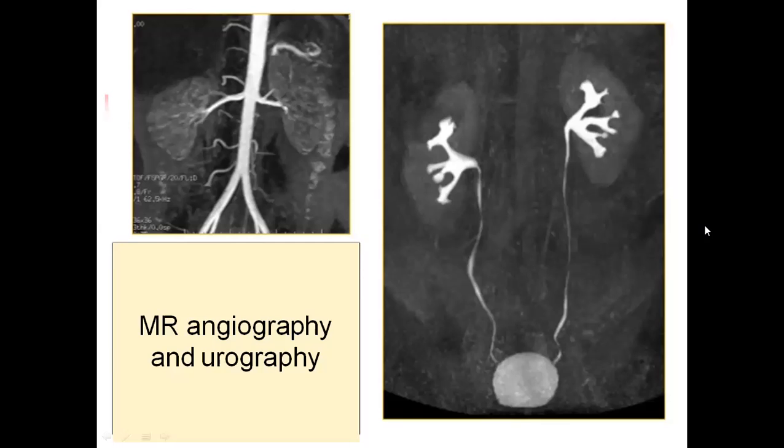Special techniques such as MRI angiography and urography, as I have said, are a very nice option and very informative, when we may take angiograms or urograms without injecting any contrast media. It is based on the physical principles of MRI study.